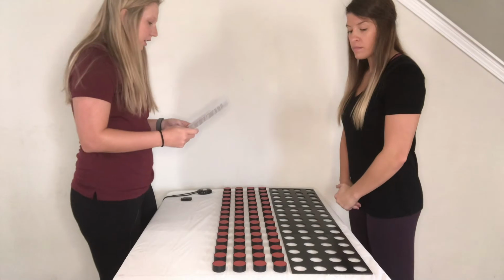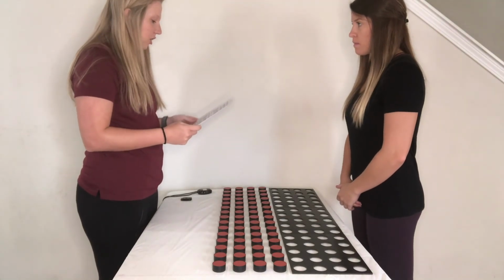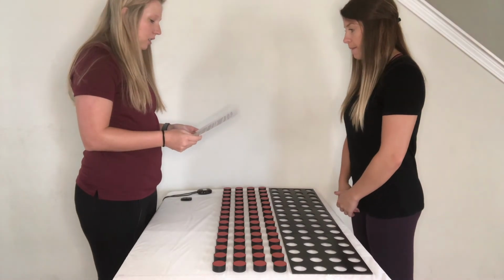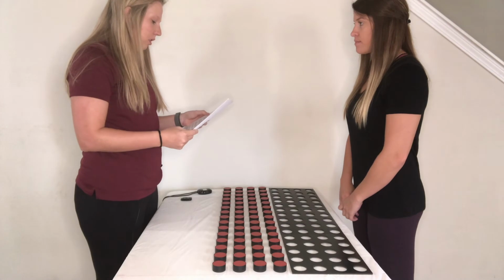The series of tests that you are going to take will measure your eye-hand-finger coordination and gross motor skills. The tests are timed, so you must complete each as quickly as you can. We'll be starting with the placing test.